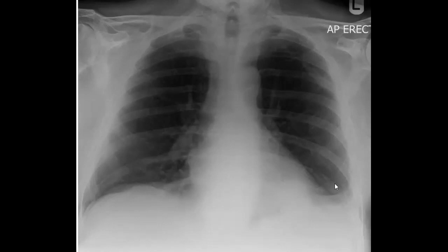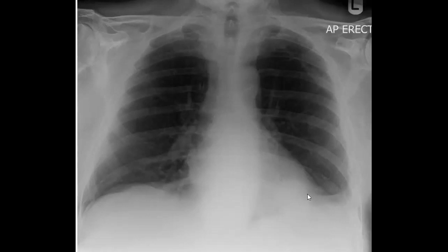Yes. Effusion, Heba. Good. That's good. Effusion, yes. That's good, but not nice. If you are nice, you will mention something more. So, inshallah, everyone will be nice. Yeah, there is a mass here. So, mass and effusion. So, cancer, and there is malignant effusion. So, mass, Ihab, thank you, Ihab. Yes, perfect. Dr. Ivan also, mashallah.